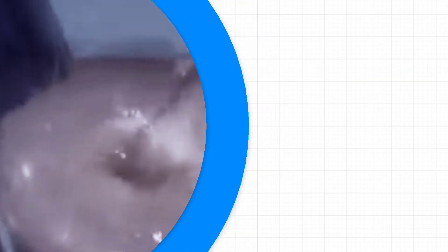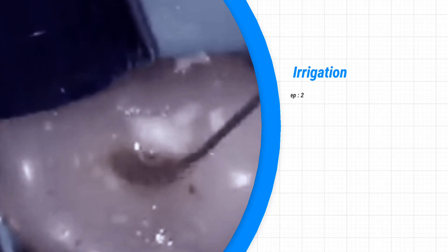Then we fill the canal with the final rinse solution. We are using sodium hypochloride as an irrigant.